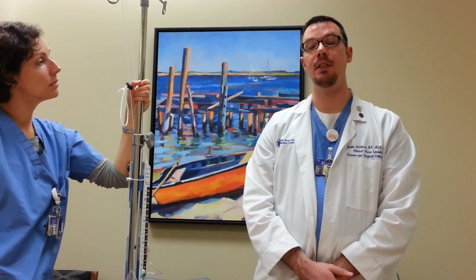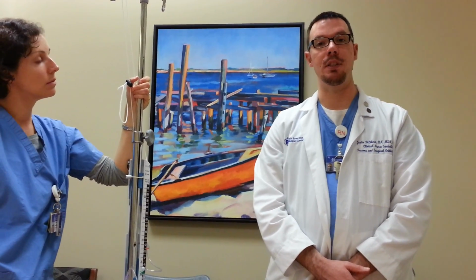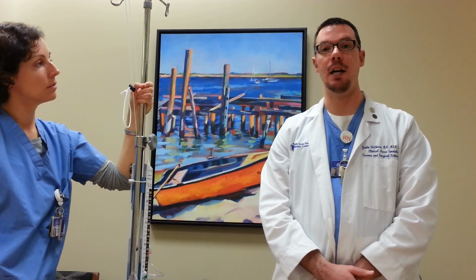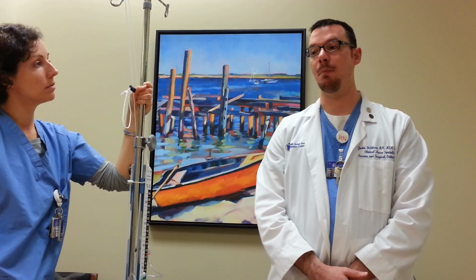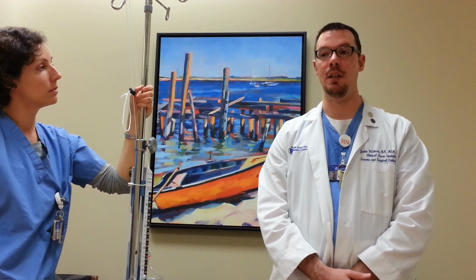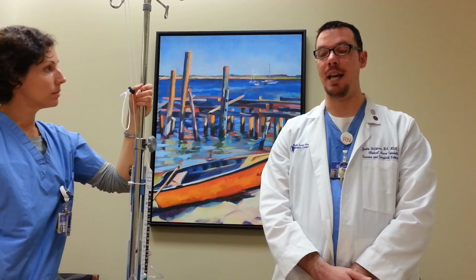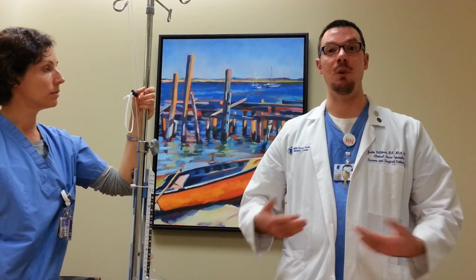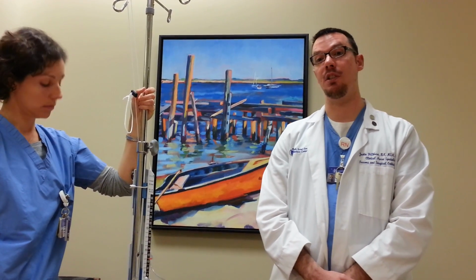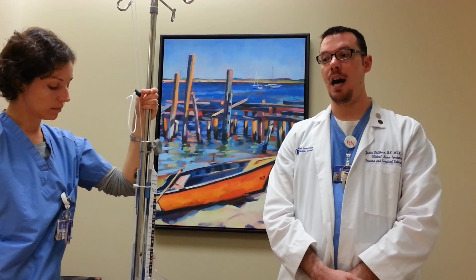Just general care in the ICU. So you may be walking in a patient's room just to perform a physical exam or to place an arterial line or whatever it is. Procedures and activities that would have almost no risk in any other population. But in order to perform these activities, you're raising and lowering the head of the bed or raising and lowering the bed itself, and obviously that's going to change the level of the tragus to the drainage device.